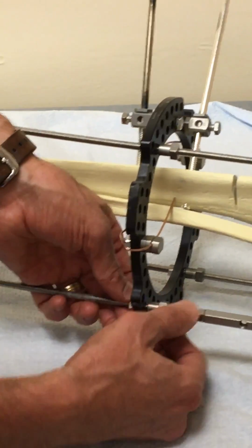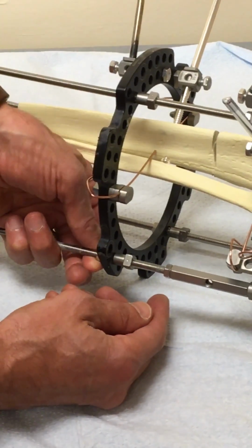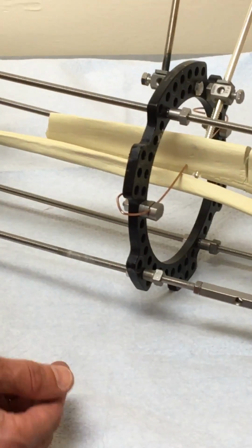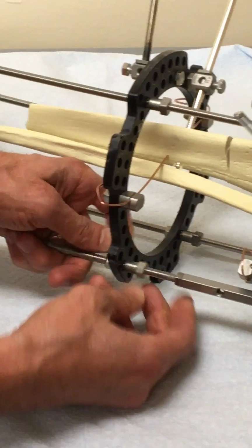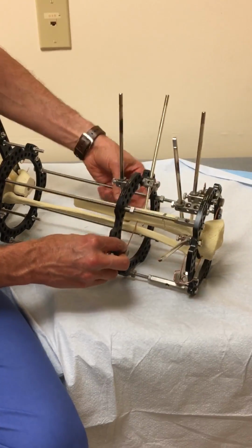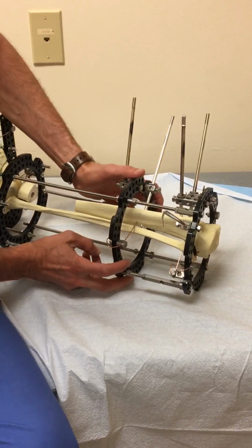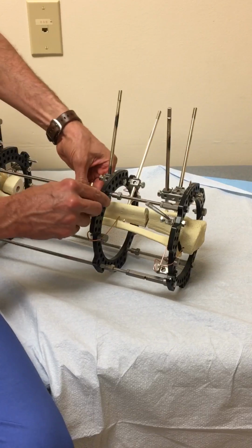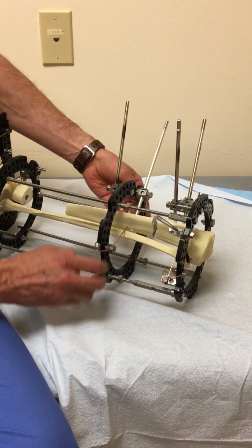And so imagine this is all tightened down, okay, like that. They loosen the bottom, they just advance this 1/4 of a turn, and then they tighten it. They go around the frame. And what that's doing is, I'll do it quickly now. They do it one at a time because they're going very slowly to make the good bone. But just showing you how this works, you see, this whole ring attached to the moving segment on the tibia is just going to move distally, okay?